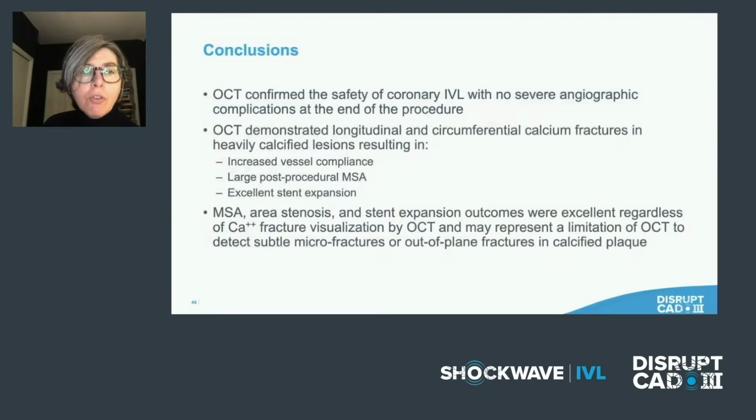So in conclusion, OCT confirmed the safety of coronary IVL with no severe angiographic complications at the end of the procedure. It demonstrated both longitudinal and circumferential calcium fractures in these heavily calcified lesions, resulting in increased vessel compliance, large post-procedural MSA, and excellent stent expansions.